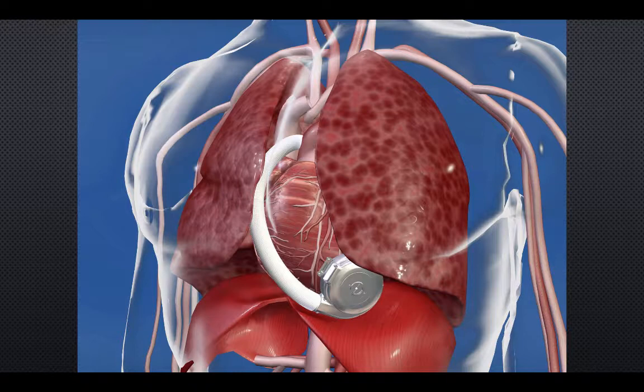Blood pressure must be measured with a manual cuff and Doppler ultrasound. The MAP is identified when the constant flow returns. MAP goals for LVAD patients is between 70 and 90 millimeters of mercury. This can also be monitored using an arterial line. Labs, including coags and troponin, should be sent when deemed necessary. Look at the patient's controller to see their parameters. These include pump speed, power, flow, and pulsatility index.